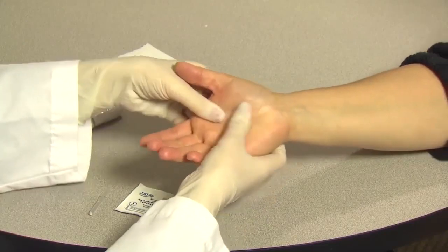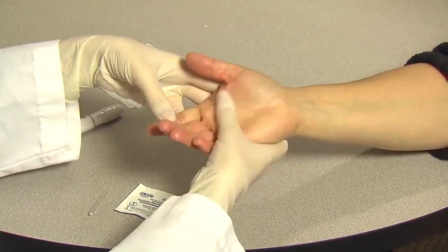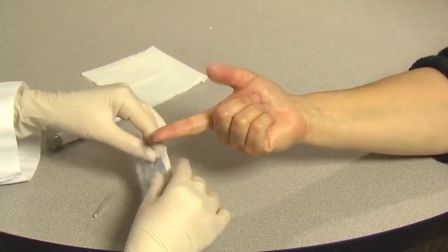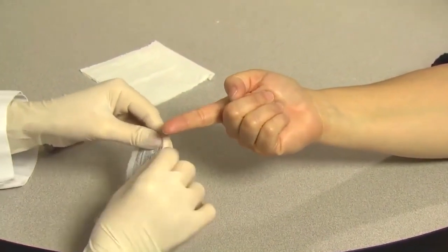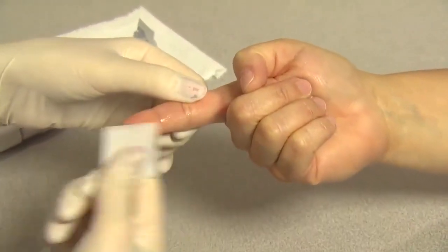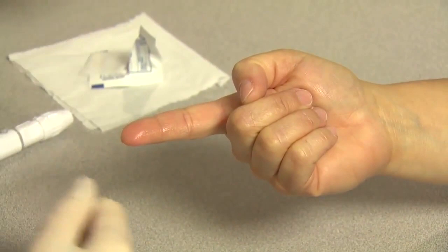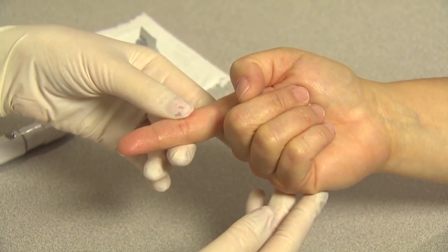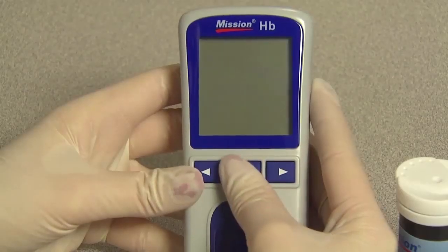Massage the hand from the wrist up to the fingertip a few times to encourage blood flow. Clean the testing site by washing your hands with warm soapy water and then dry them thoroughly. You could also choose to use an alcohol swab instead to clean the testing site and then let it air dry completely before testing. Turn on the meter.